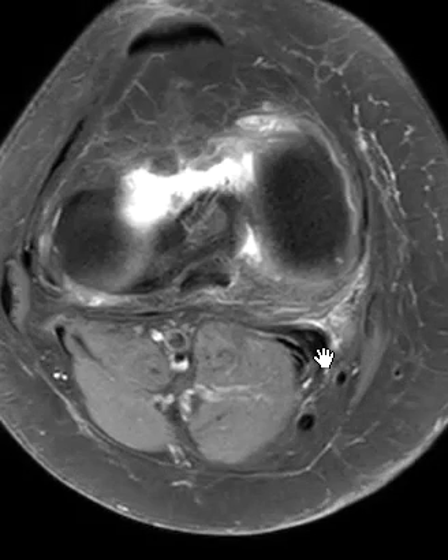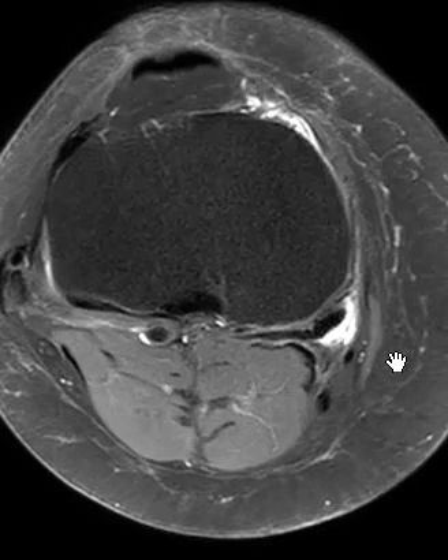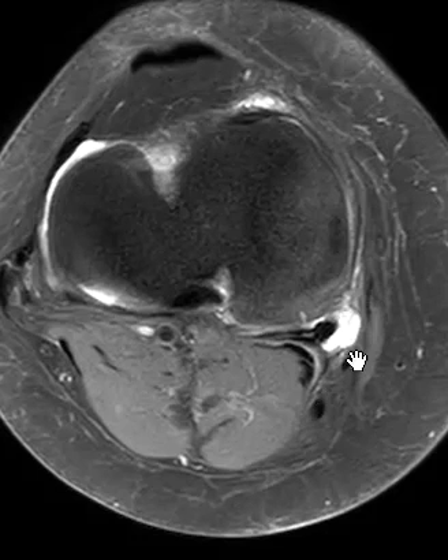We're going to see this area over here where the finding is — this is called the semimembranosus tendon. We're going to watch it come down, and now the fluid is there. Now it's starting to attach to bone. You can see that fluid right around the semimembranosus attachment. There are some other tendons over here called the pes anserine tendons — one, two, three. So an inflamed bursa in the posterior medial knee. Thank you very much.